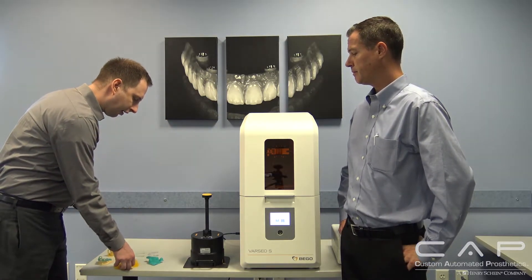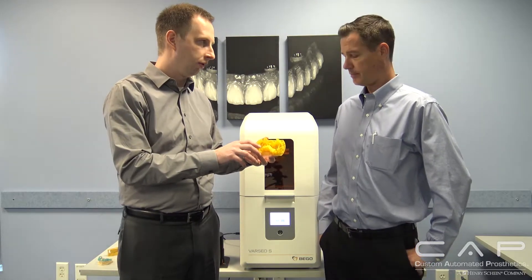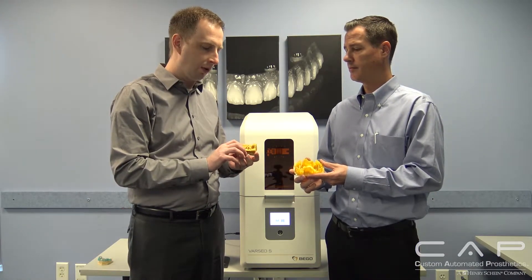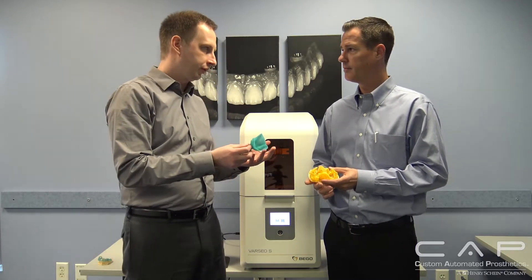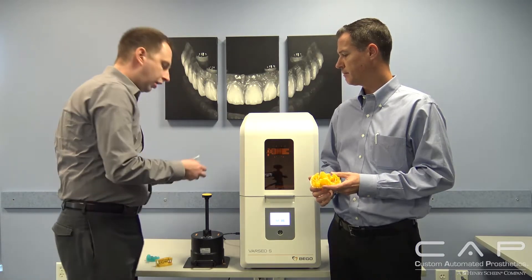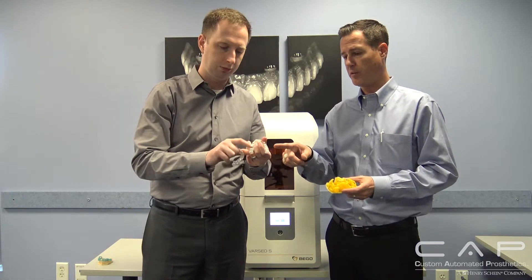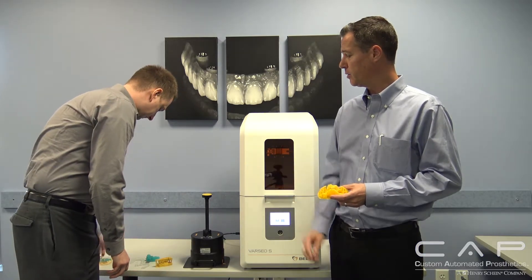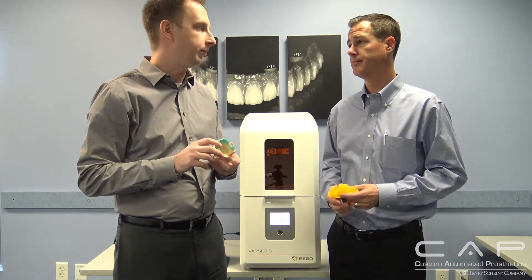For materials, today we have castable — primarily for partials with a complete workflow — and this is a great example of the build plate size. We also have a model material producing really nice high-resolution dies and models. They also have a custom impression tray material used in the mouth, and then a splint and night guard material — you can see one version unfinished and the polished version which is crystal clear. That splint material is really hot right now. The last material available is our surgical guide. And in 2018, we're going to have temporary material and denture base to round out the portfolio.